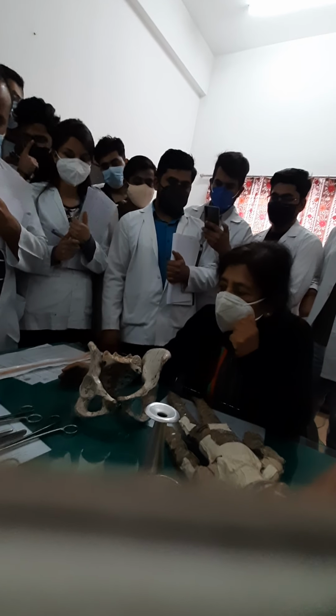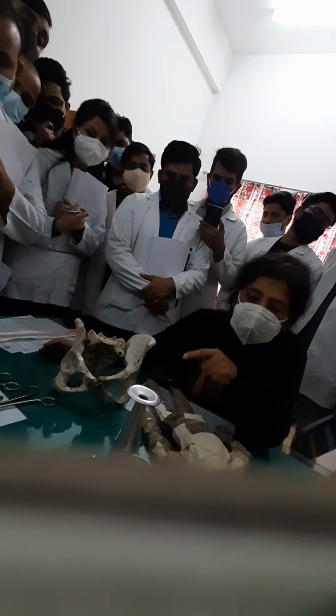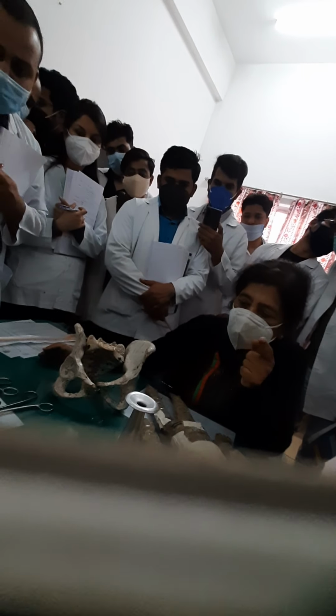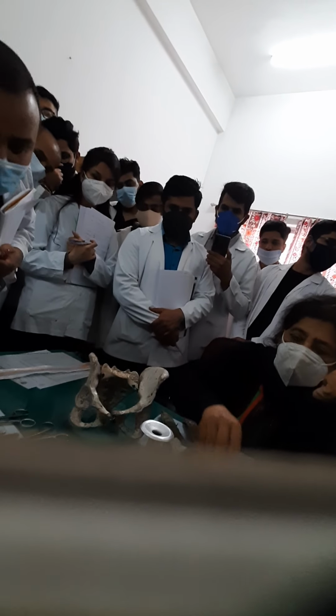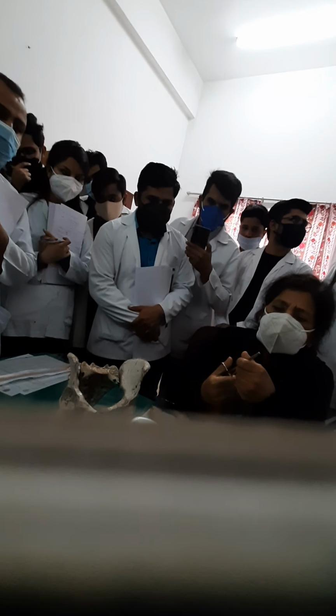Where is the coccus forceps here? Instead of keeping it here, it's kept there. Oh? Okay.